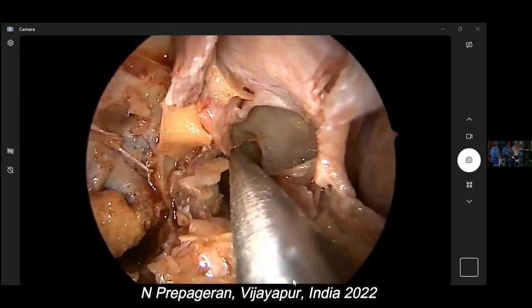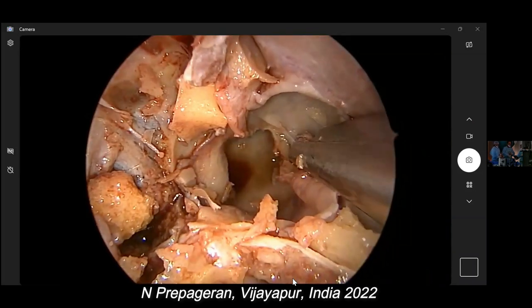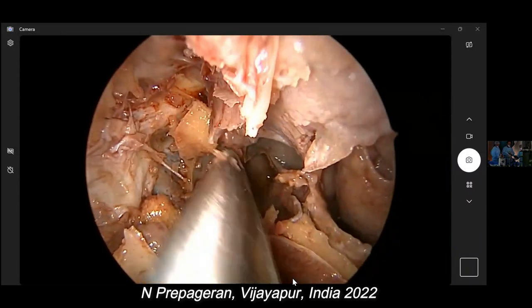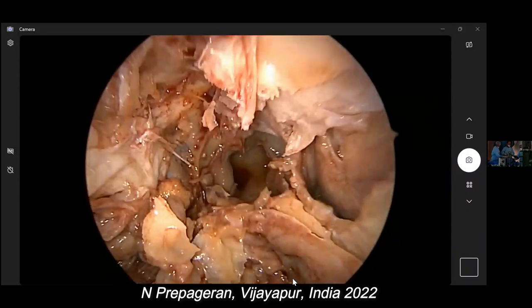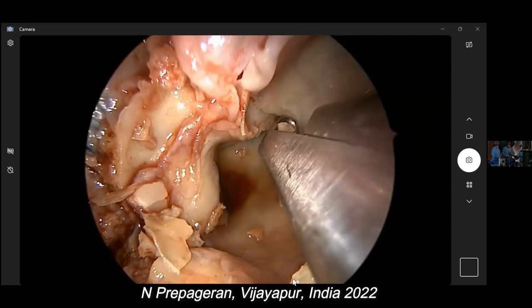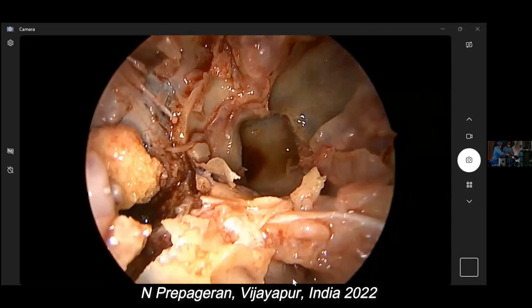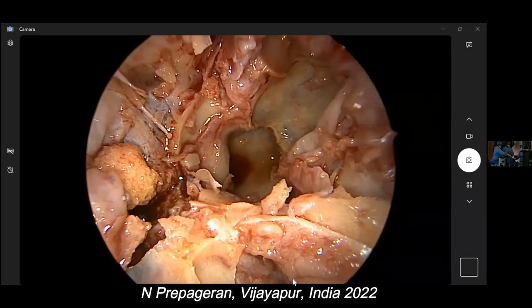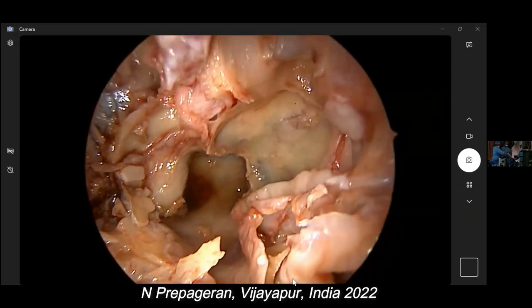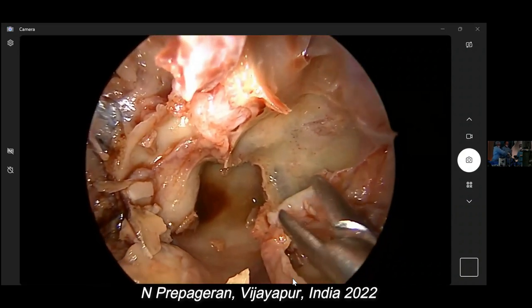It would have been very nice to have an IGS for this. It would have shown us the anatomy very nicely, but it's okay. We manage. We always do. So I need to see the OCR on the other side for me to complete my surgery. I've removed the anterior shell. That is the optic nerve, maybe. Yes. No. Not sure.